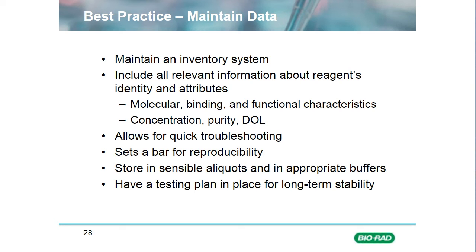And have a plan in place for long-term stability testing. Remember, it isn't just antibodies that can degrade over time with repeated freeze-thaw cycles. Care and planning should also be taken with the antigen that's going to be used in such tests.